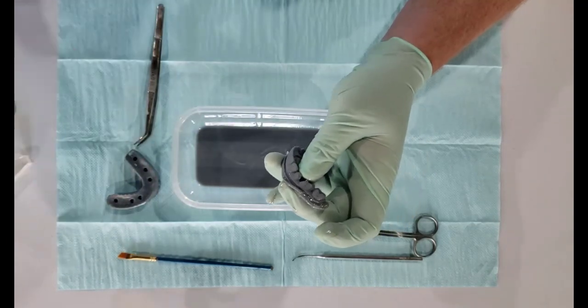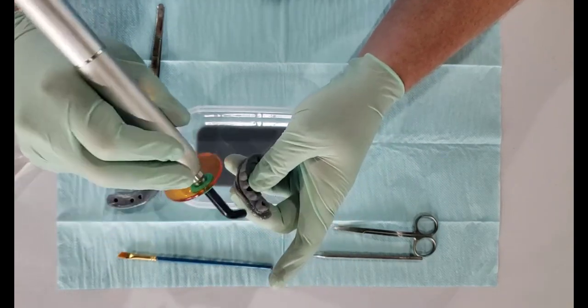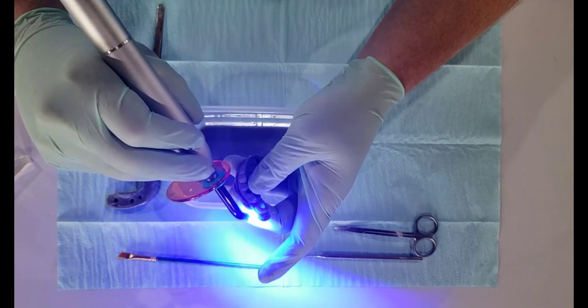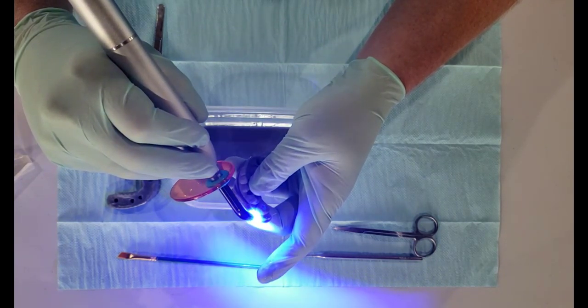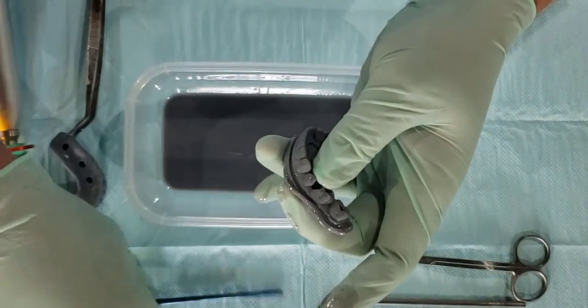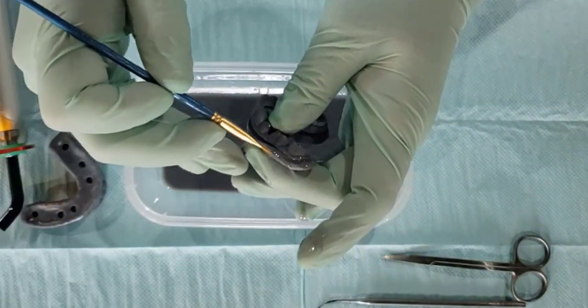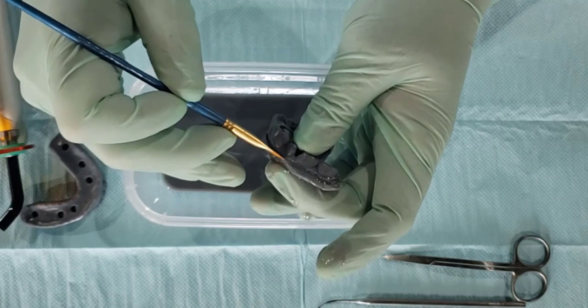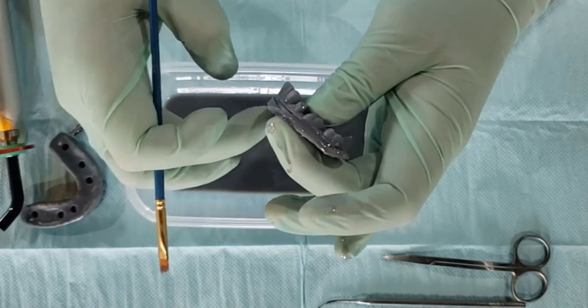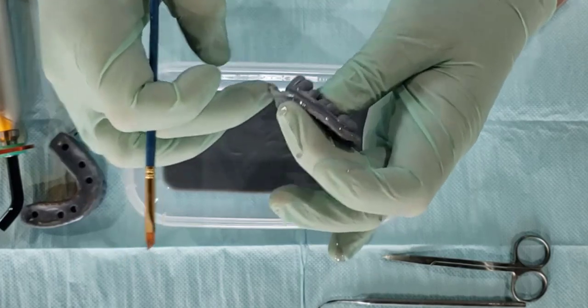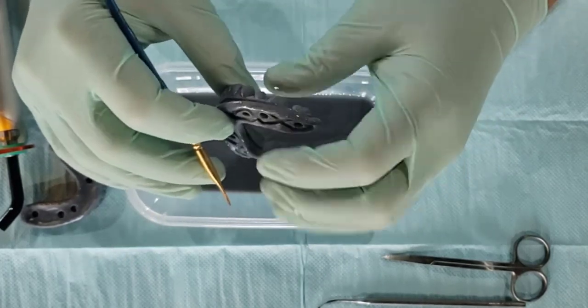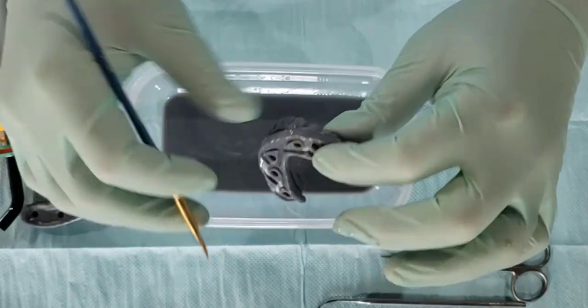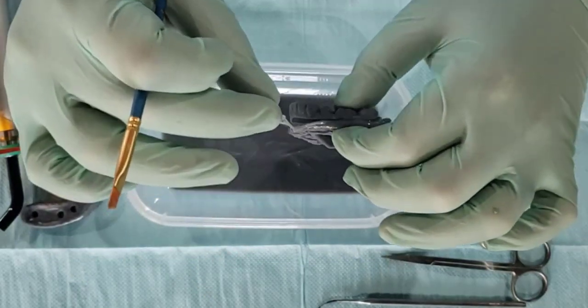As I work my way along, I'm just going to tack it, because once that's tacked in on an area, that's going to make it a lot easier to handle from that point forward. I'm just using a brush. The only downside to this, you can kind of get a little messy, so you want to keep your hands and working field clean.